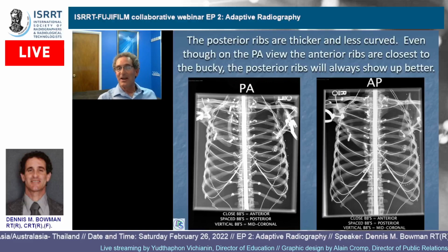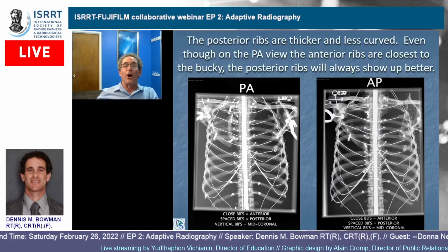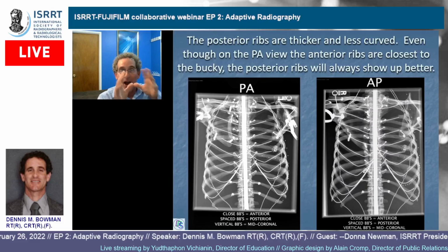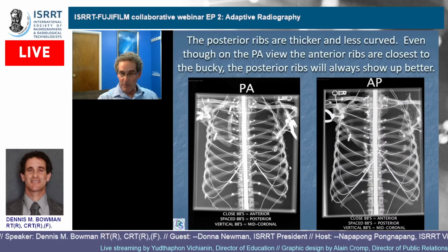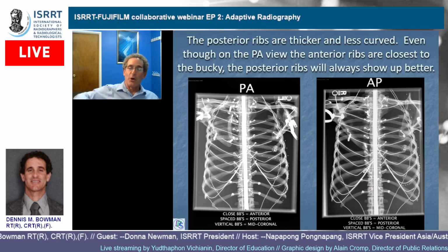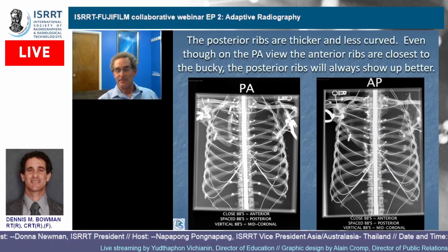So we took Billy, and I'll go through this whole craziness of a picture, but we put these BBs on. We have these little BBs that we actually put on ribs when you're doing a rib series, so the radiologist knows kind of where to center their eyes and look at where the person hurts the most. And so we took a bunch of those and we spaced them out on the posteriors and we put them really close together on the anteriors. And then right at mid-coronal, we have that line going up and down so that you would know when a posterior ended and an anterior began.